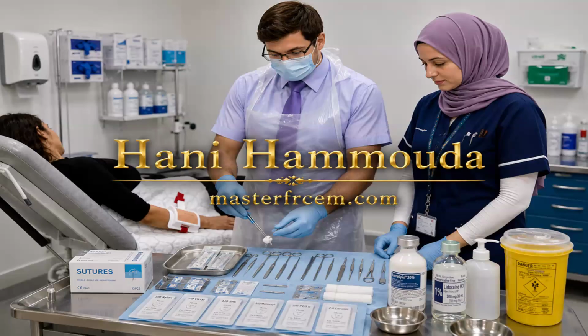Okay, so preparation. I've got my nurse and I have got all the equipment ready here, and we'll clean the area with normal saline inside, and outside we will do betadine, and we'll cover it with a drape. Then I'll use some local anesthetic with 1% lidocaine. And I believe you didn't mention you have got any allergy. If any complication develops, we will keep intralipid available.